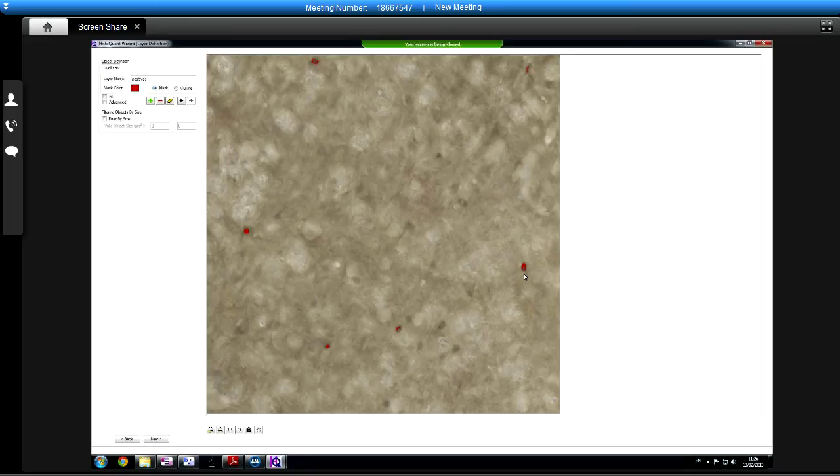If you want to know what it's actually doing here, if you click on the Advanced button, what you see is a way of expressing colour. There are two ways. Most people probably know about RGB, red, green, blue. Every colour is a combination of red, green and blue. And then there's a second method, which is HSV, which I think stands for hue, saturation and volume. They call it another colour space.